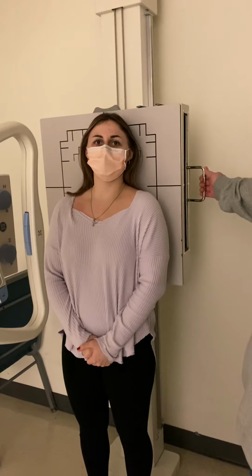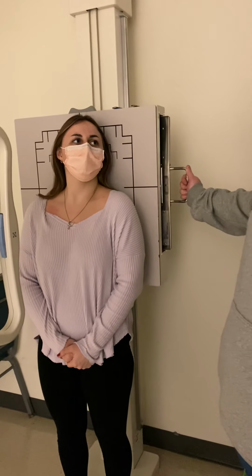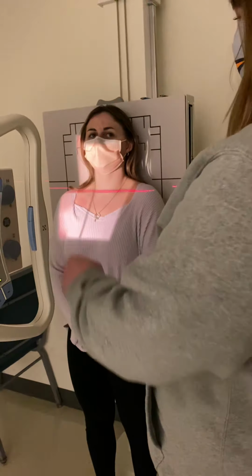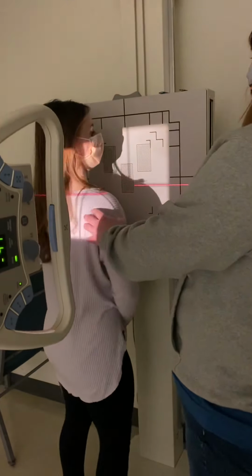So to start off, when you do a projection of the orbits, you usually prefer a non-grid technique. Like the lateral nasal bones, we would just pull this out. But since that's not an option in every imaging facility, we're just going to go ahead and use the grid today.